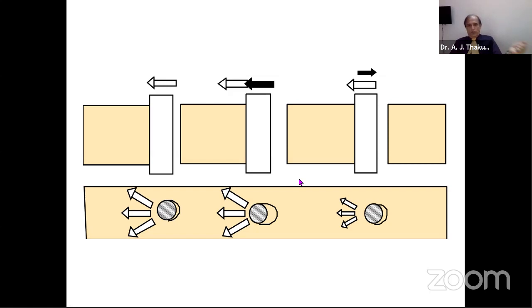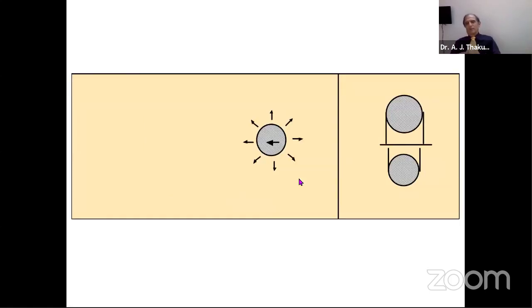What could we do next? Engineers always help us. So they devised a method called radial preloading. In this, a pilot hole is made, but the pin is tapered. The distal end of the pin is narrow, and the part which is going to abut the proximal cortex is wider. So it's a tapering pin. The tip of the pin is, say, 5 millimeters, and where the threadings end, it is going to be 6 millimeters.